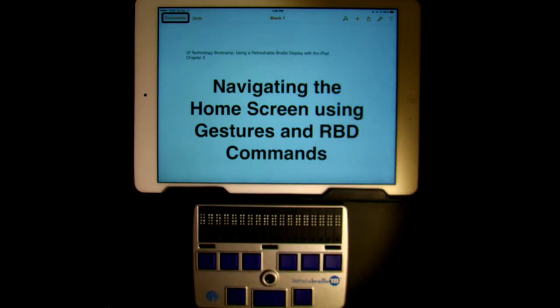The refreshable Braille display allows a Braille user to easily navigate and drive the iPad without touching the iPad screen. Remember that chord means that the Braille input keys and the space bar are pressed simultaneously.